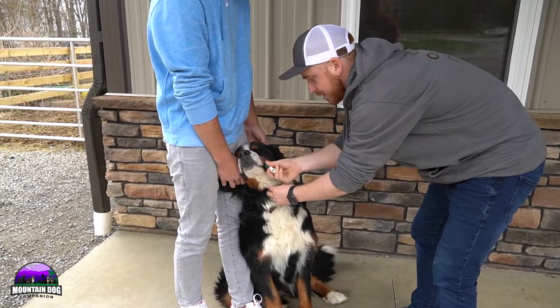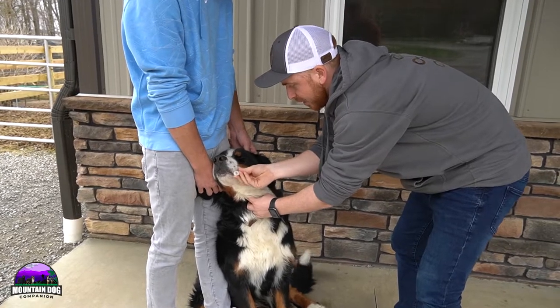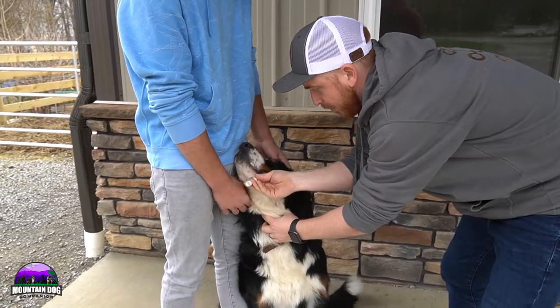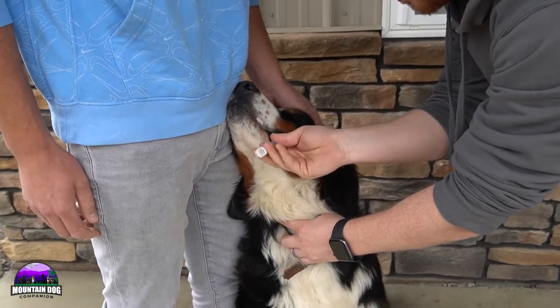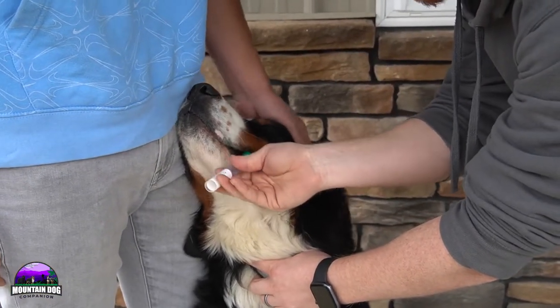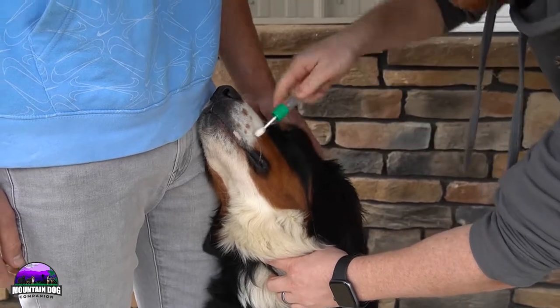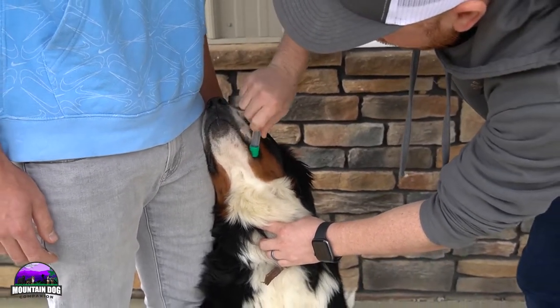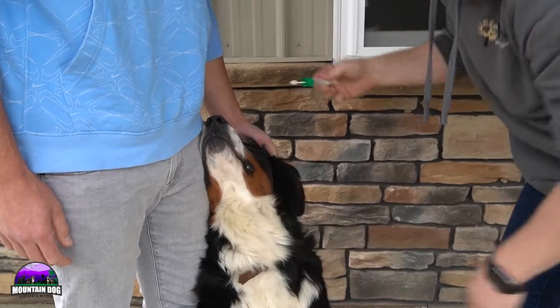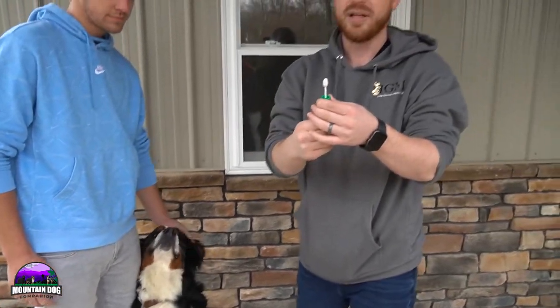And then once we're done swabbing this, I'm going to be able to unscrew this cap. It has a liquid that I'm going to be able to place it in, and they're going to be able to test it underneath a machine that does all the genetic testing — the DM, all that good stuff. You also want to make sure that the dog hasn't eaten before as well.